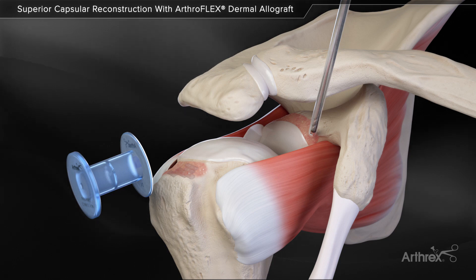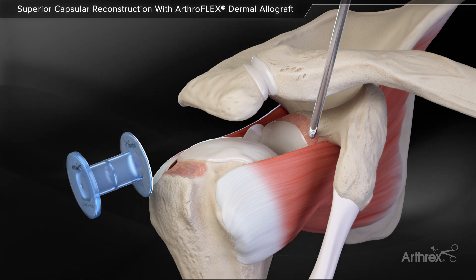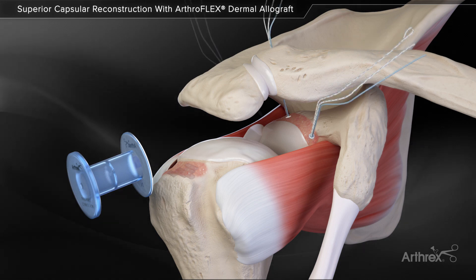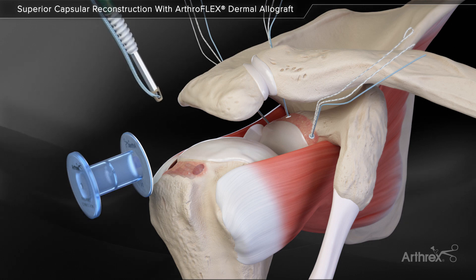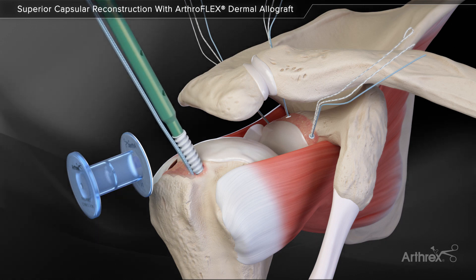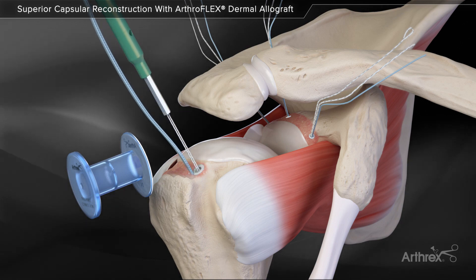Three 3.9 mm knotless corkscrew anchors are inserted into the superior glenoid through percutaneous skin incisions spanning the glenoid from anterior to posterior. Two biocomposite swivel lock anchors preloaded with fiber tape are inserted into the prepared footprint of the greater tuberosity.